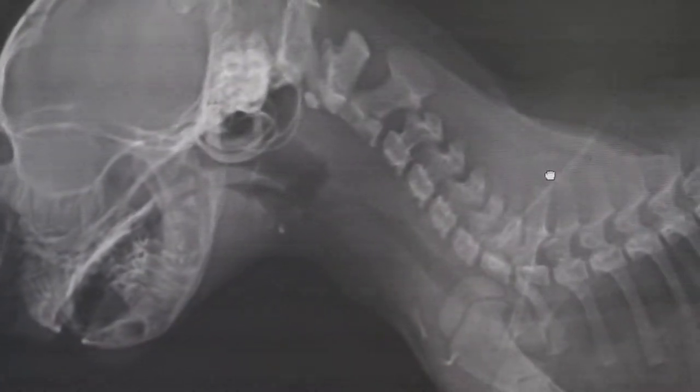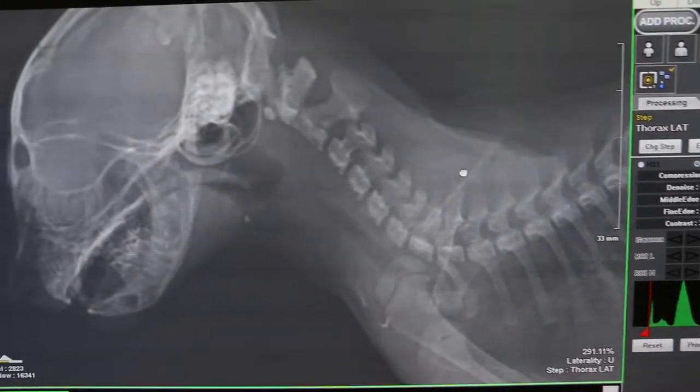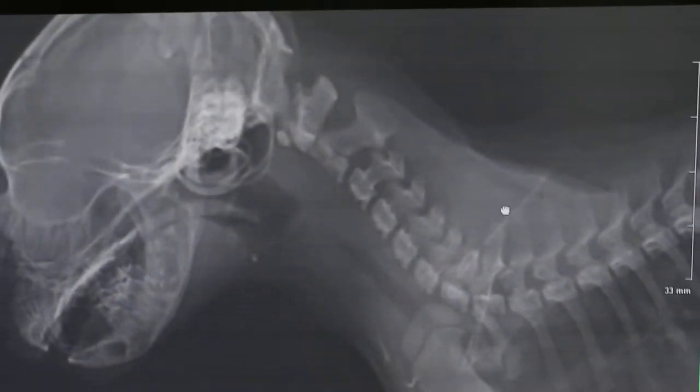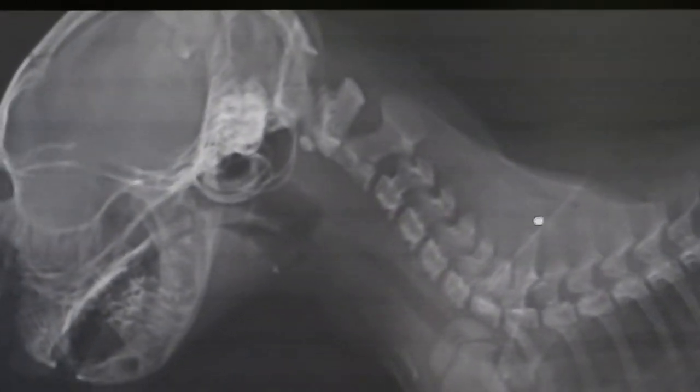That's what my son says, it's a bone. So this side. Bone normally can see. She says she was doing some sewing and then, don't know what, a plastic thing for the sewing, then the kitten swallowed it.